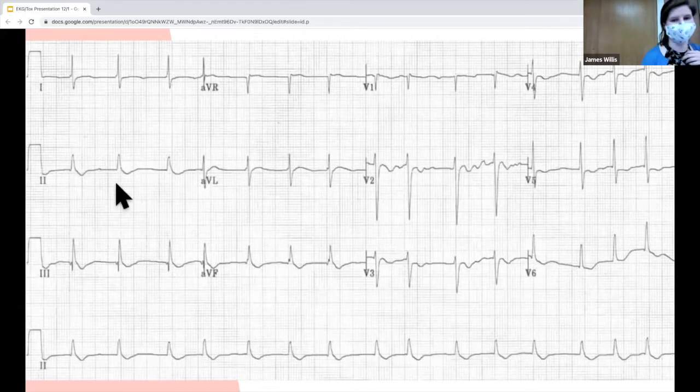Short? Okay, good. Anyone have any idea what medication this is? And I direct you to the ST segment shape. This may be a clue. Perfect. But is this someone who took way too much digoxin?